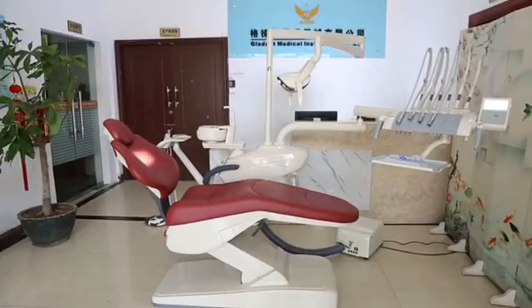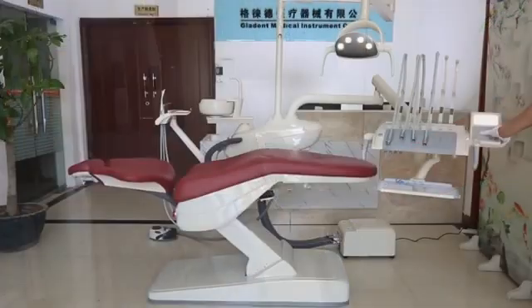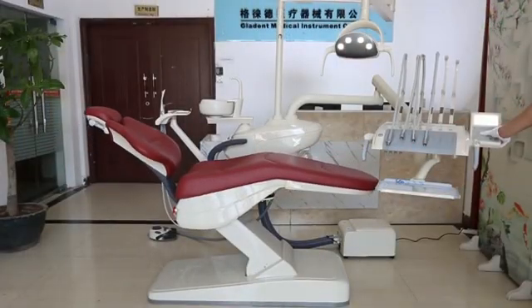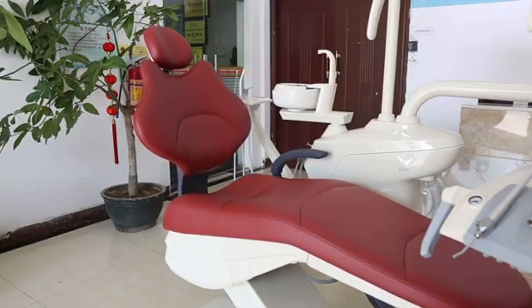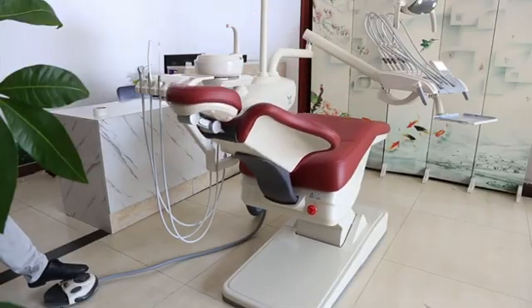CE and FDA-approved Gladant Dental Unit GDS800 is an integral dental unit designed ergonomically and modernly. It features a full pipeline disinfection system to prevent cross-infection during treatment.